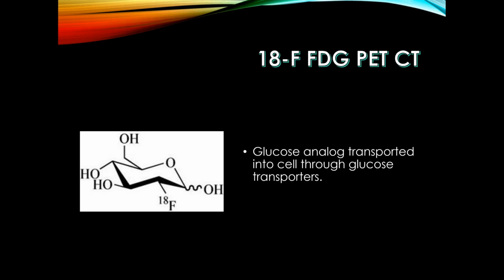Okay, switching gears now, let's talk about FDG PET CT, because some patients will now have an FDG PET CT, and I guess the question is why. As you know, FDG PET CT is really the first routine PET study that we've done for tumor, and it's most commonly used in things such as lung cancer, colon cancer, ovarian cancer, and all sorts of different cancers.